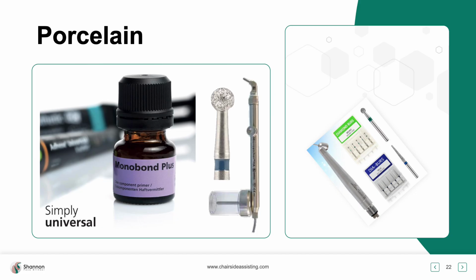And there's a couple of things about that. First thing is that if we talk about porcelain, one of the things that my old dentist used to do is he would sandblast the whole entire tooth. And here we go again. We're removing that beautiful shine, removing the glaze. We cannot put the patient's head back in the oven. So we want to make sure that we micro etch only a small area, or we can use a small round diamond. And using that round diamond is what's going to allow us to really only roughen up the area of where that attachment is going to go.